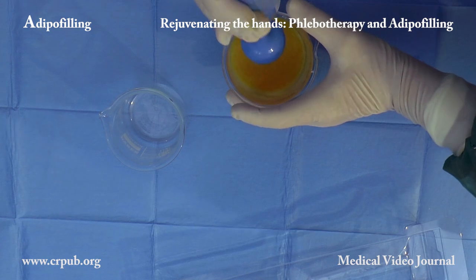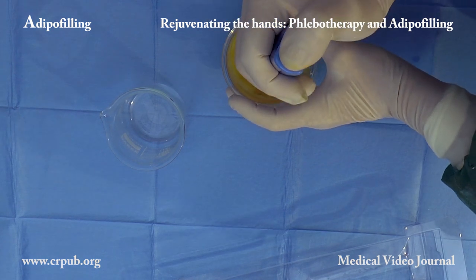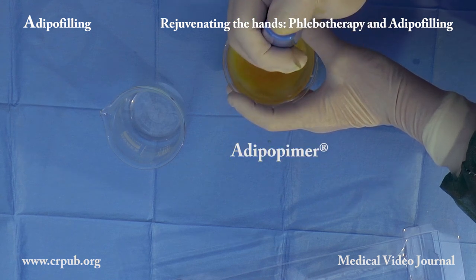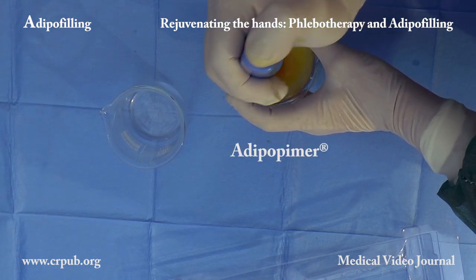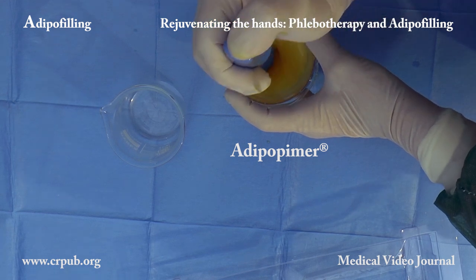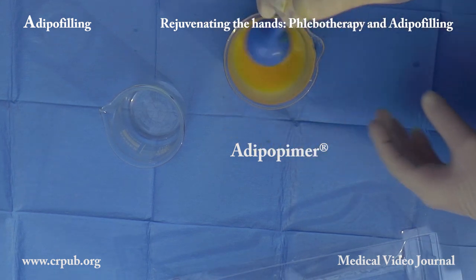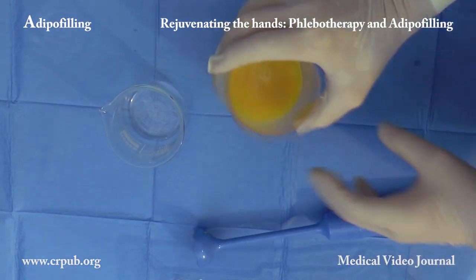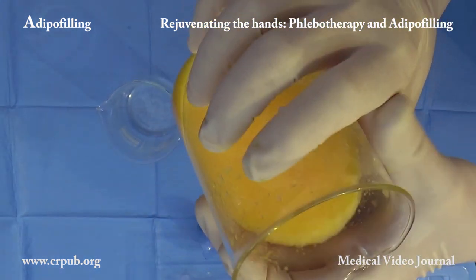The cap is removed from the adipopima and the bell-end of the device is immersed into the washed lipoaspirate. The aspiration vortex created by the adipopima fragments the lobules in a few seconds, producing the suspension to be used in volumetric adipofilling.